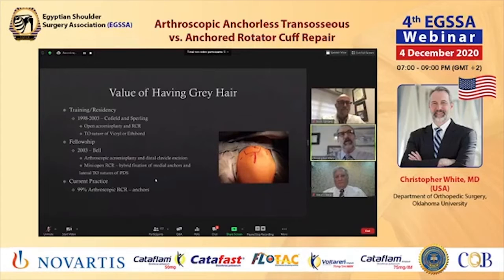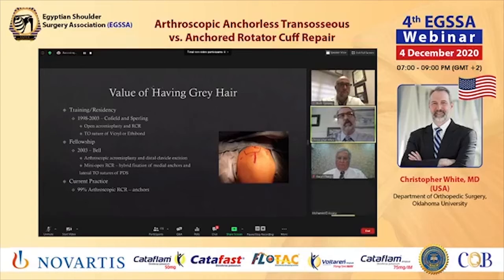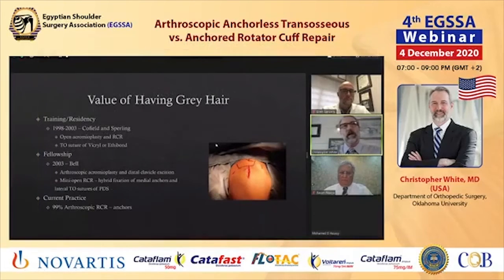When I moved to my fellowship with Mr. Bell in Melbourne, we did arthroscopic acromioplasties and distal clavicle excisions routinely, but almost all of our rotator cuff repairs were mini open with a hybrid construct fixation with titanium metal anchors and lateral transosseous sutures with PDS. But now, 17 years later, 99% of my rotator cuff repairs are arthroscopic, and indeed, I use anchors to accomplish that.